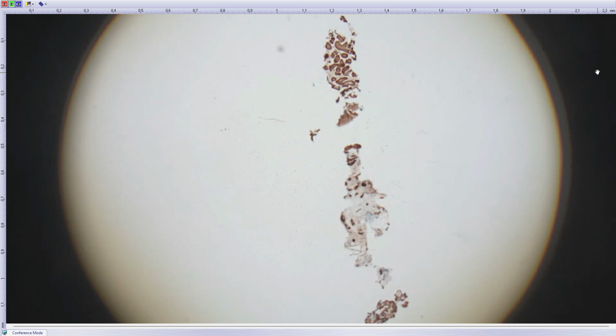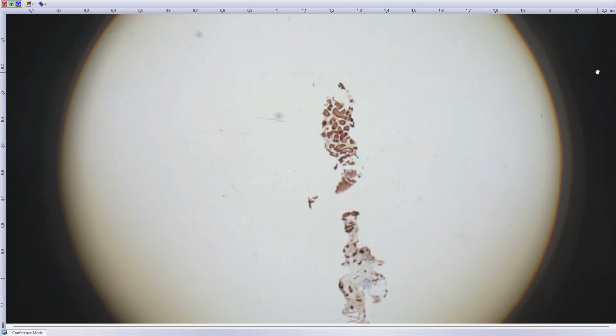And of course, the lesion was positive for SOX10 with some CK7 positivity in the luminal cells, and some P63 was positive. And importantly, this is beta-catenin staining.